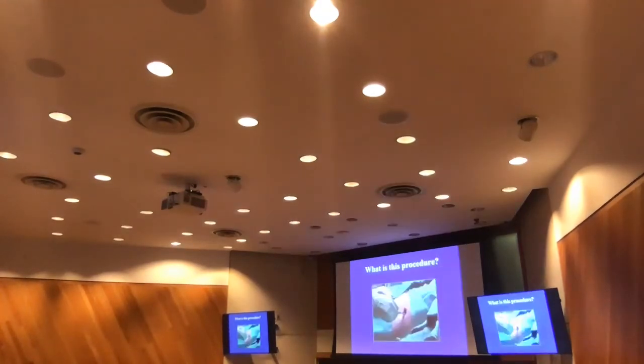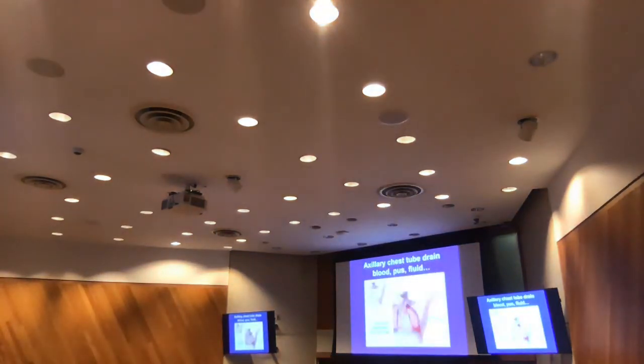Okay, what do we do? That's the testing, that's the real thing. Not the interventional catheter that you can put in at the bedside instantly. This will require some draping, some sterilizing, bringing a scalpel and lidocaine. You have this package, you open up the surgical kit. This is the incision made over the sixth rib most of the time. It could be the fifth rib, could be the seventh rib, depending on what you are dealing with. And that's where the chest tube should go.